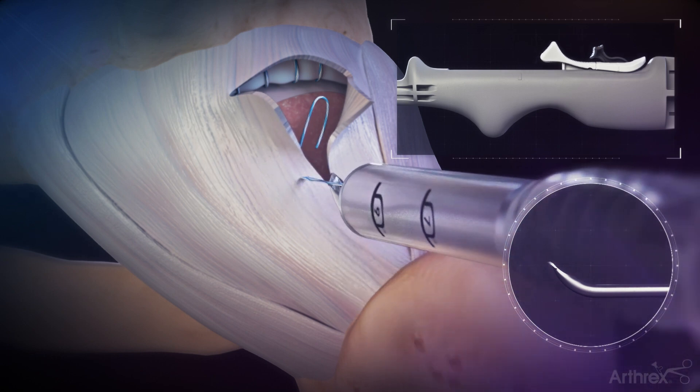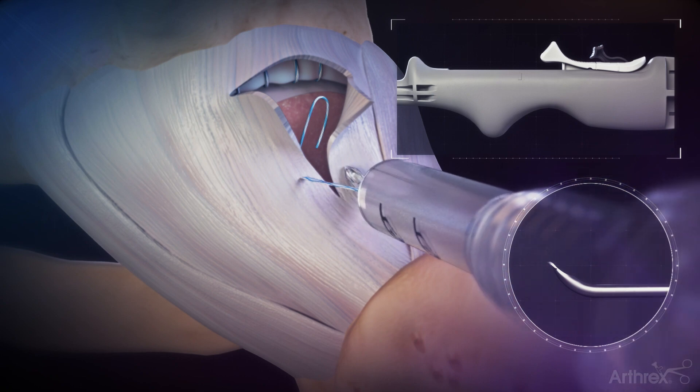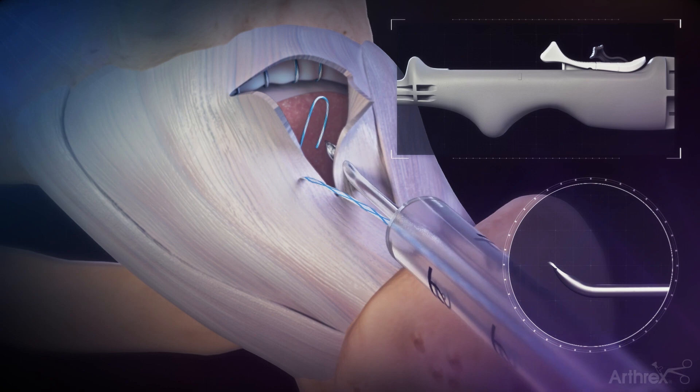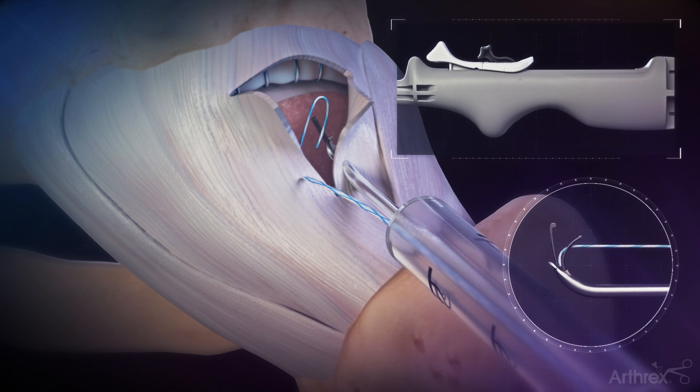Remove the needle from the capsular leaflet. With the device still in the pericapsular space, push it through the distal lateral capsular leaflet to retrieve the passed suture. Push the white sliding actuator down and forward so the nitinol jaws are located next to the suture. Once the suture is loaded into the nitinol jaws, pull the black switch backward to capture the suture in the PEEK tubing.